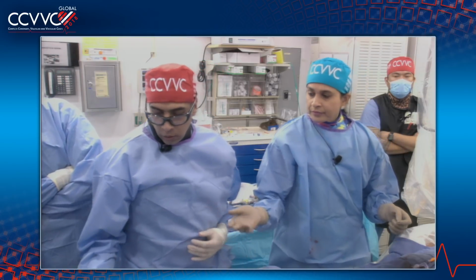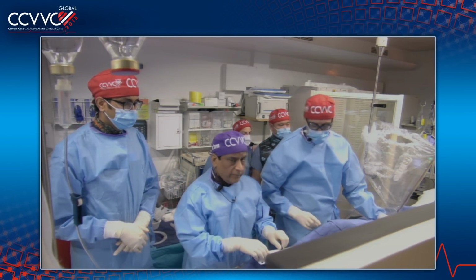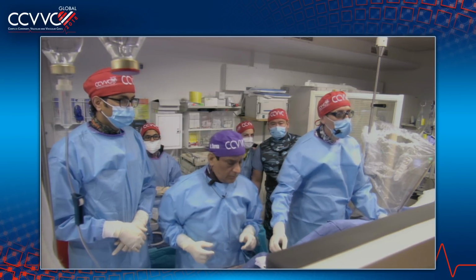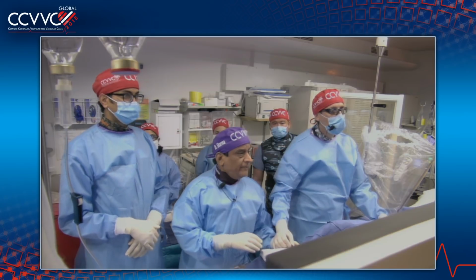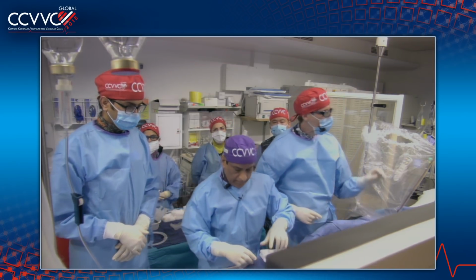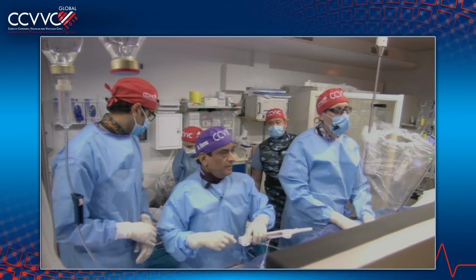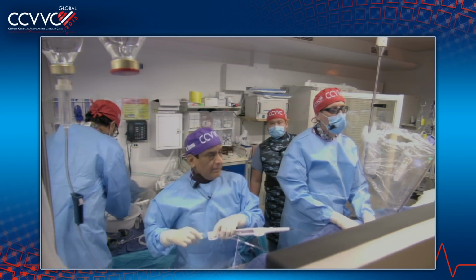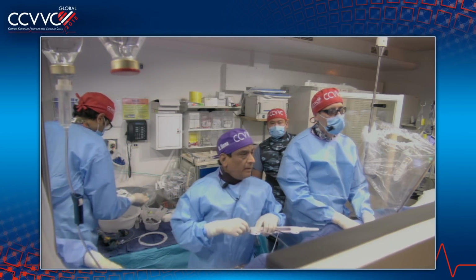Great. Let's go to lab 3, Dr. Sharma and Dr. Dangas. Okay. Hello, we see you. Can you guys hear us? We are just 1 second. Oh, they're doing rotational atherectomy. Okay, come out. Let's take it out, and we'll put the wire in. All right, just 1 second. Guys, let me have this.